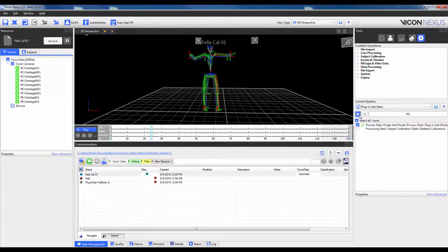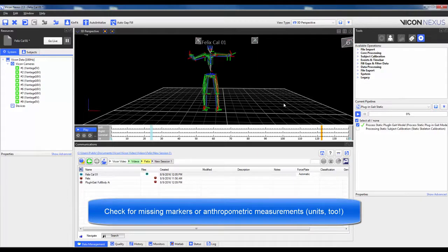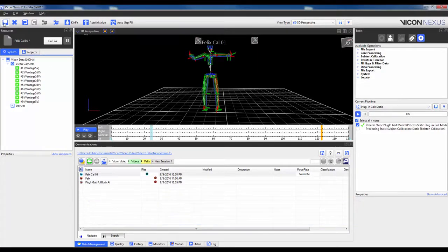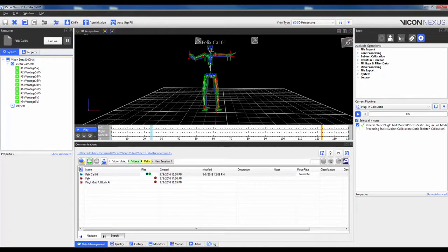If this pipeline fails, the main causes are either a missing marker or a missing anthropometric measurement. Lastly, make sure to save the trial. So from here, I'd be ready to capture a dynamic trial by hitting Go Live and then going into the Data Capture tab.